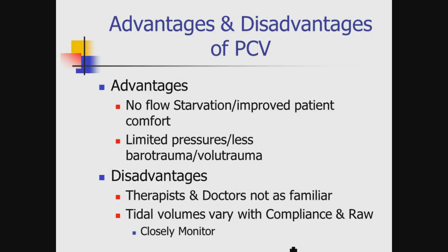So, do you think it's still pretty true? I disagree with you on this one. Do you? Yeah, because I don't think we use pressure control ventilation as much as we use dual mode, and I don't think people still understand dual mode. Oh, good point there. You're right. And they don't understand. I think we're using volume control. Yeah, so I have to disagree with you on this. Okay. Well, therapists and docs not as familiar, so we are true. True. We are correct then.